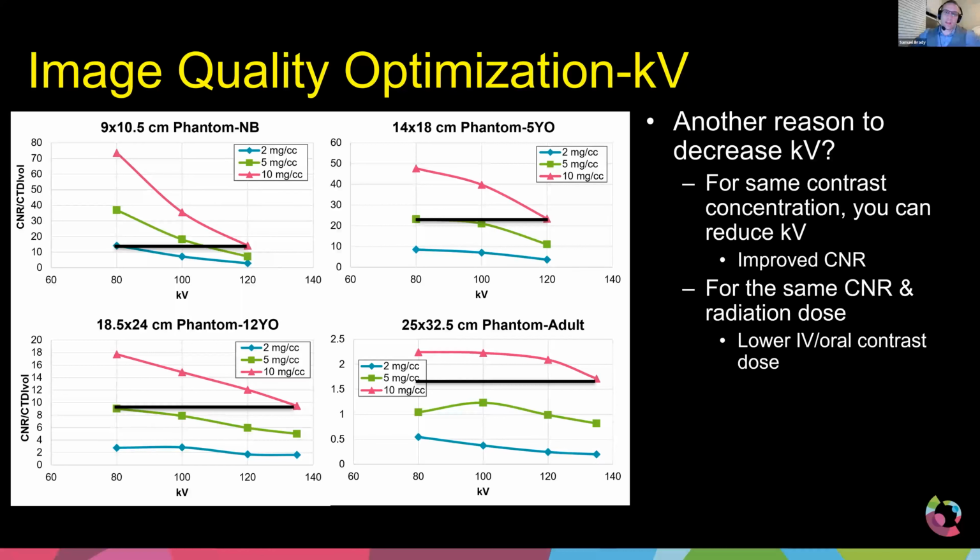And so maybe someone has compromised kidneys, or we're talking a very young patient and we don't want to overburden or overload their system. Maybe you're doing a CTA, and those tend to have a higher concentration and a higher overall dosing of iodine. But if we simply optimized our protocols at a lower kV, we could reduce some of that burden.